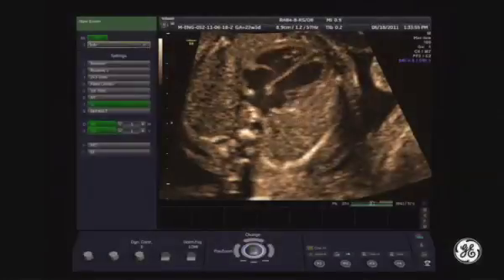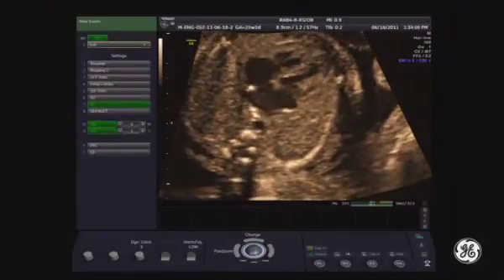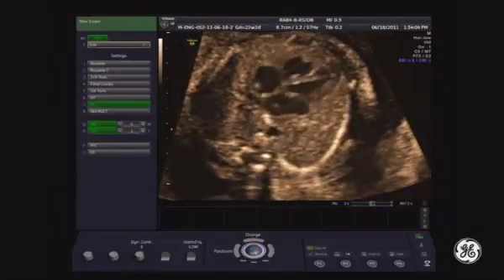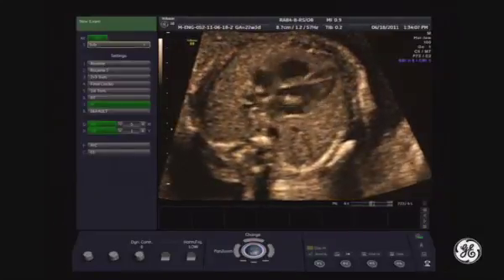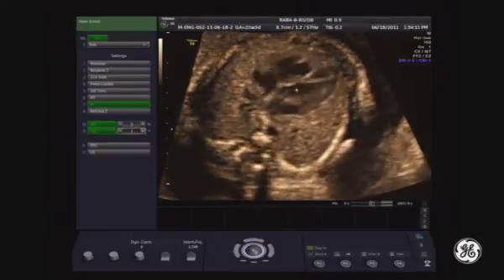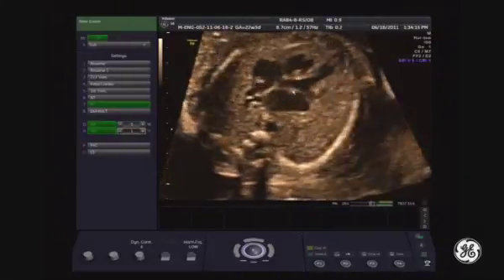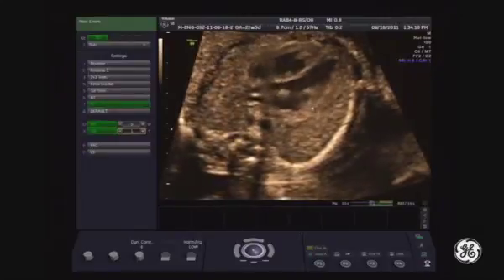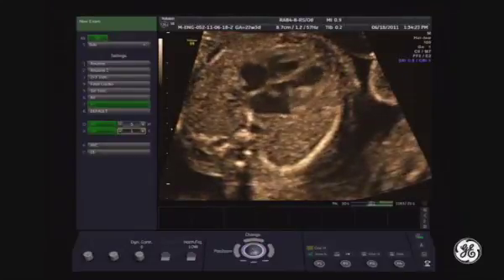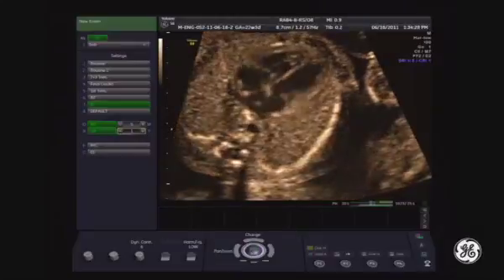Now I will present the process of acquisition of the fetal heart in STIC mode. To do that, you need to keep the section through the fetal thorax symmetrically. And you will place the original plane of acquisition at the level of the aortic root, that is called the 5-chamber view. Do not mistake this with the LVOT, which is actually the oblique view. So we come back to the 4-chamber view, and a bit higher level is the 5-chamber view.